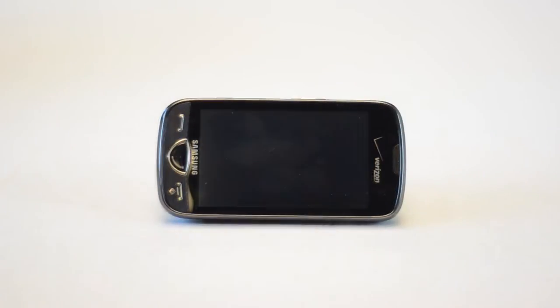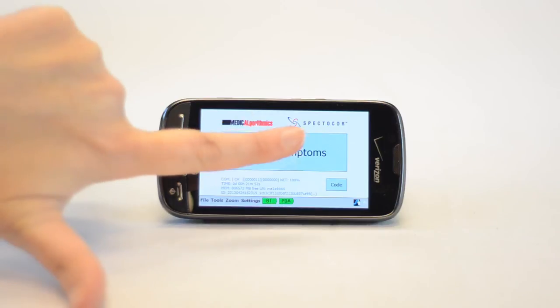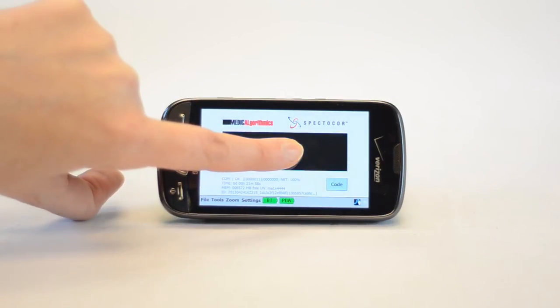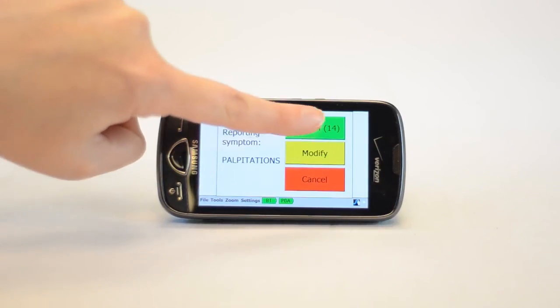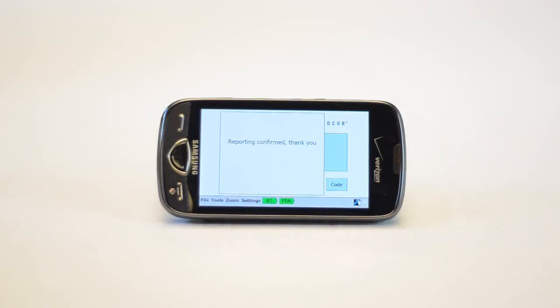To report your symptoms, use the Report Symptoms button on your PDA and hold for three seconds. Choose your symptom, confirm the symptom, then choose your activity. Your symptoms will be reported.